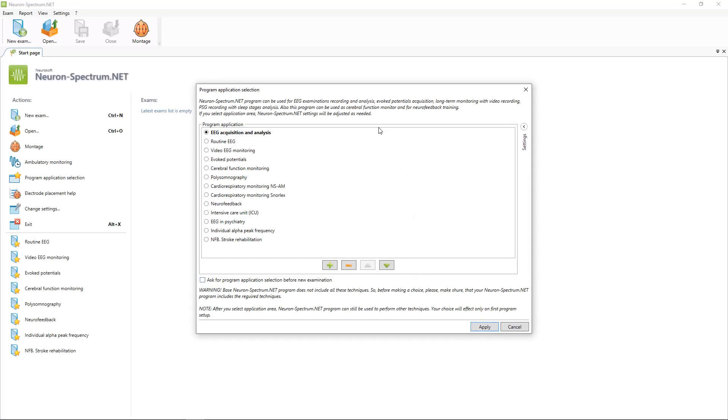And the last step which is necessary to do after the first start of the software is to select the program application which you will use most often.